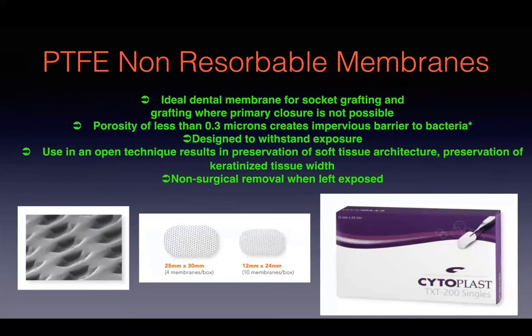PTFE non-resorbable membrane. These membranes were designed specifically for extraction site grafting and augmentation procedures where exposure to the oral cavity is common. It's resistant to bacterial invasion due to their small porosity. And these membranes can be left exposed in the mouth without much complication. I like using these a lot.